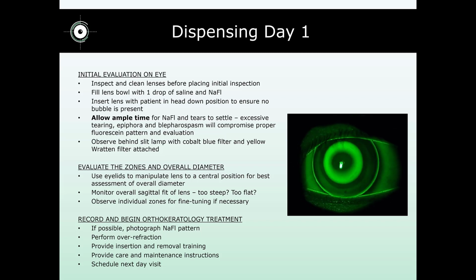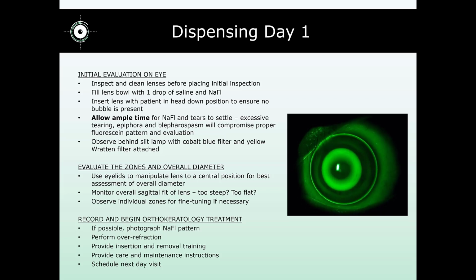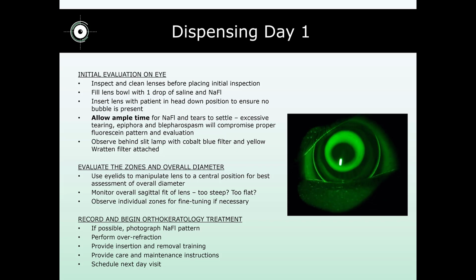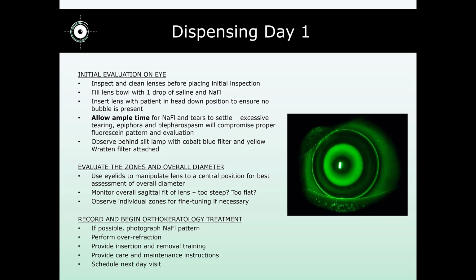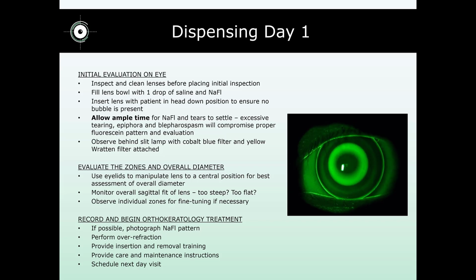Finally, record and begin orthokeratology treatment. If possible, photograph the fluorescein pattern. Perform over-refraction. Provide insertion and removal training. Provide care and maintenance instructions, and schedule next day visit.